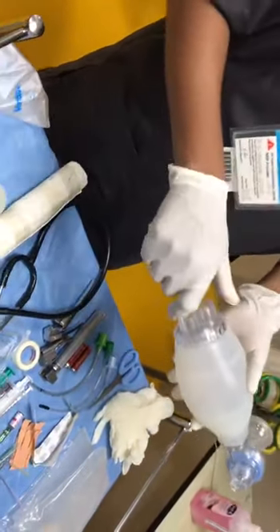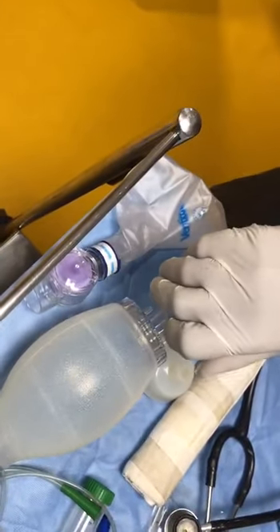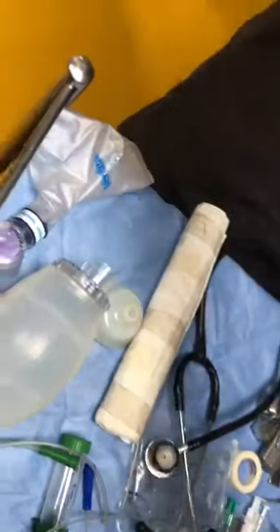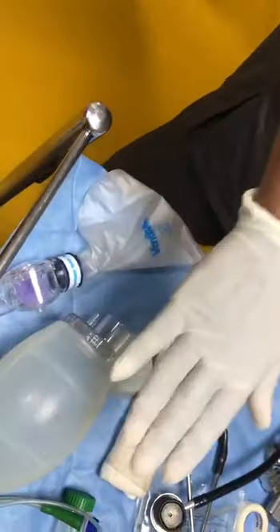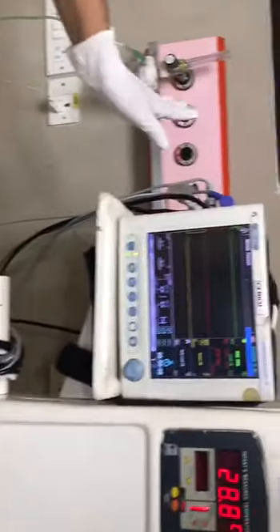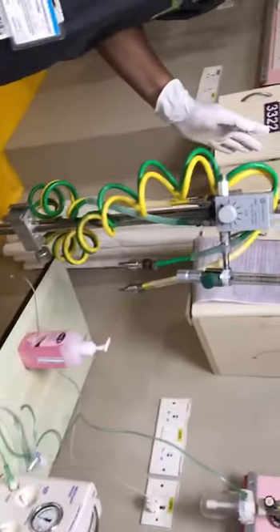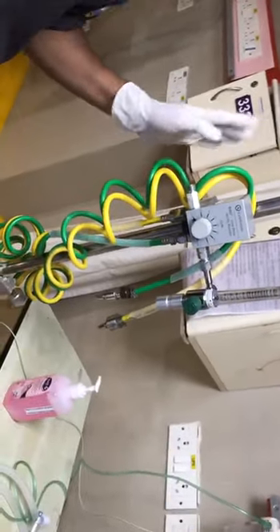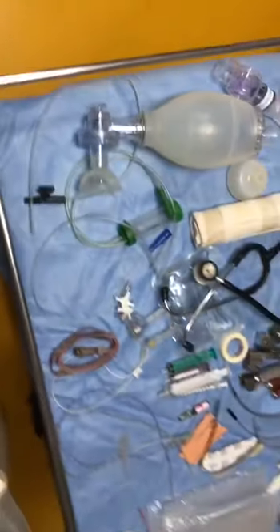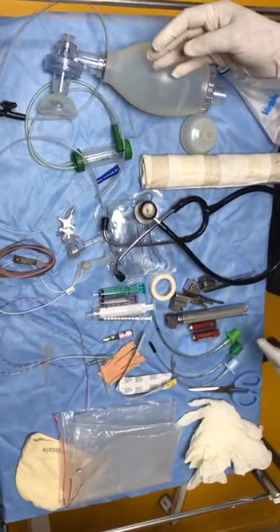And I would like to have a reservoir also, if the baby needs 100% oxygen. Can I have a reservoir also here? It's fine, it's there already. Reservoir is there, so if at all I need, I can use it. And there's a pulse oximeter already. You have to use it. And a blender, if at all the baby needs more than 21% oxygen, we may need to use the blender also. It's ready already. Oxygenation part I finished, I hope, already.